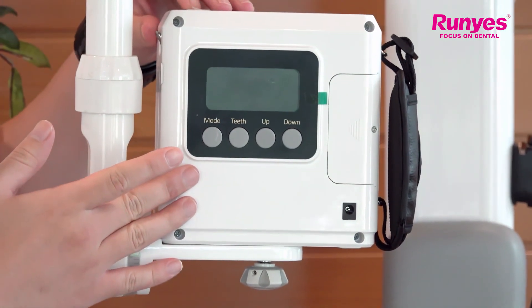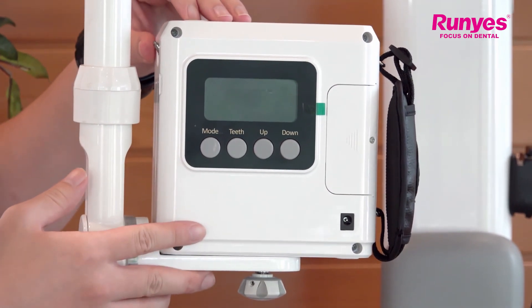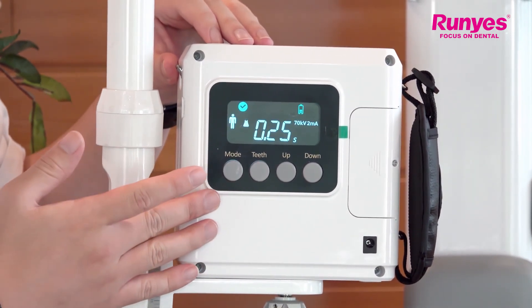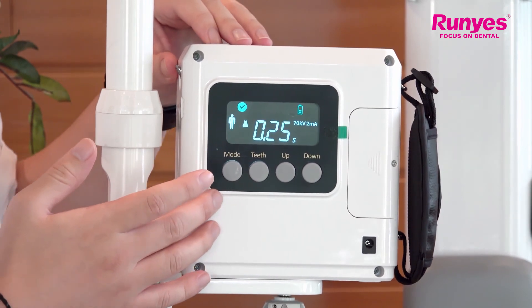First I will turn on the portable x-ray by long pressing this power switch button to turn on. And after starting up, all icons in the display will light up in the full screen for about one second to check whether there are any problems with the display.